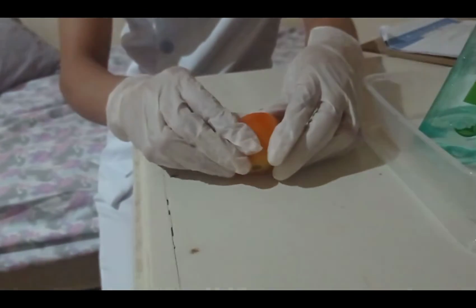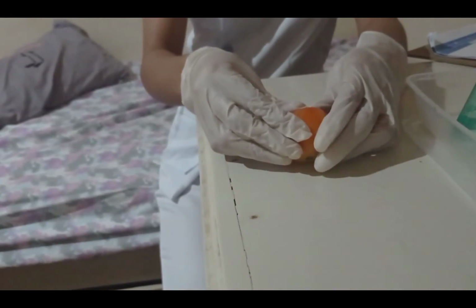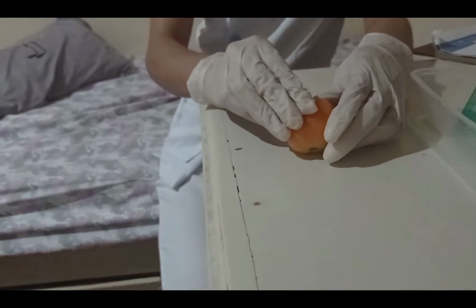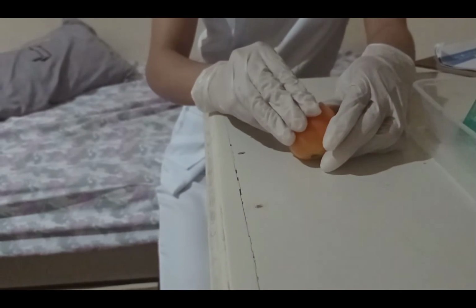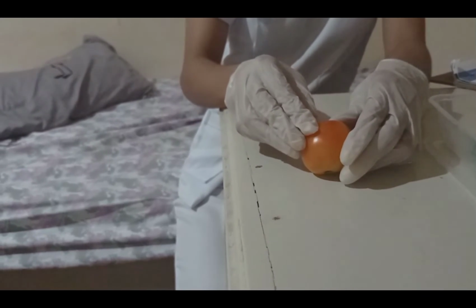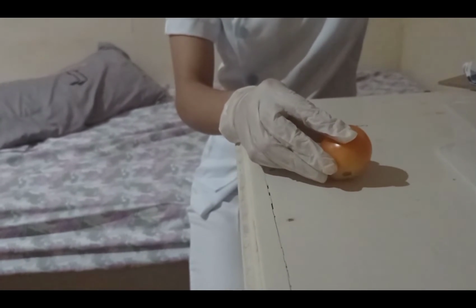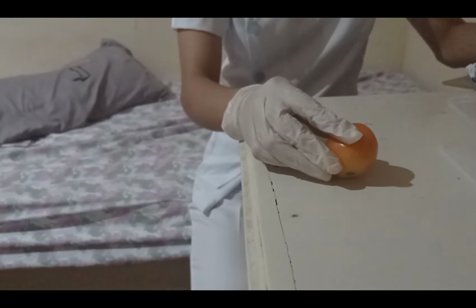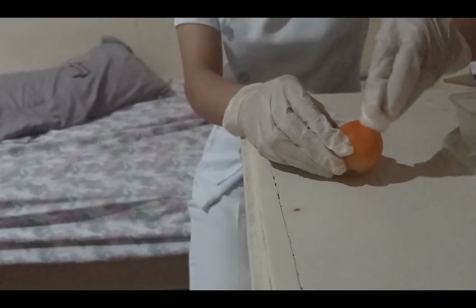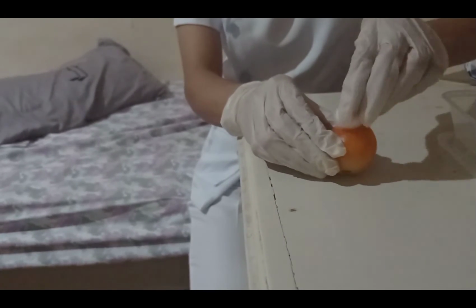The hepatitis B can be administered at the outer mid thigh, while the IPV is administered at the outer left upper thigh, the pentavalent vaccine at the outer right upper thigh, and the PCV at the outer left upper thigh. We should clean the area with warm water and allow the site to dry completely. Allowing the site to dry prevents stinging during the injection.